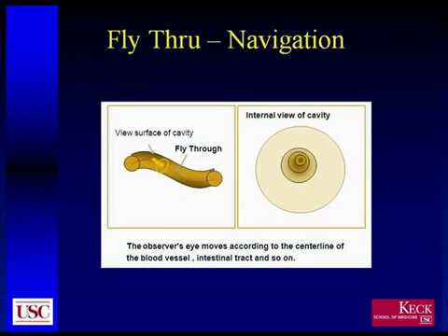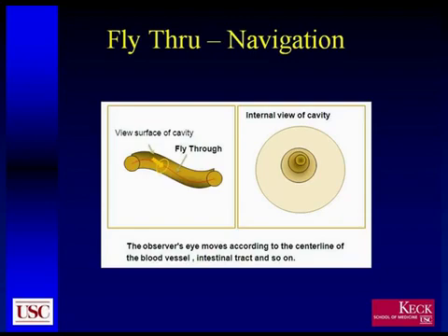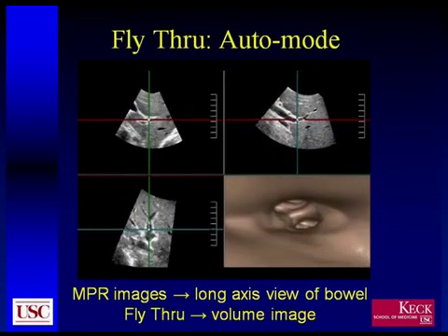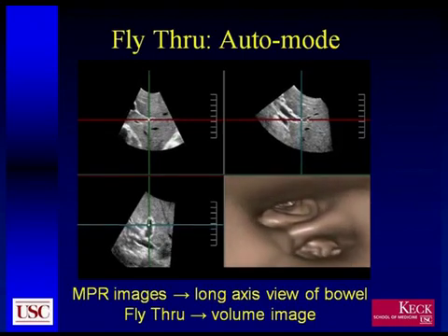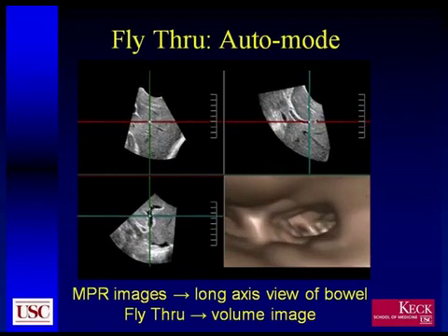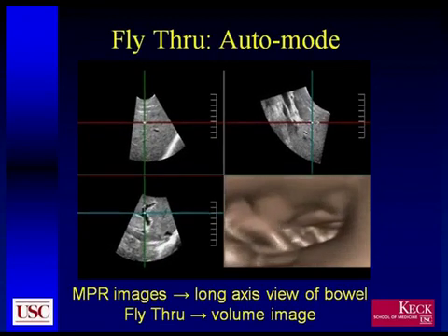There are various ways to view these images. The machine itself will actually navigate through structures for you, and the observer's viewpoint moves according to the center line of the blood vessel. The actual projection travels directly through the center line, whether you're looking at a blood vessel, the gut, or any other fluid-filled structure within the body. In auto mode, it essentially passes through the tubular structure — you can see it branching here — and in this particular case, through the branches of the portal vein.